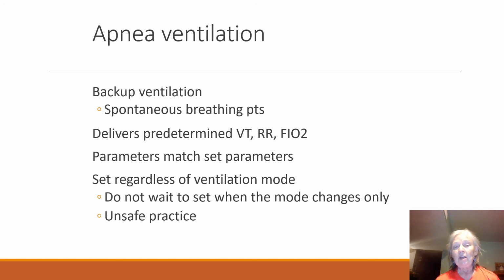She stopped breathing. 300 is a whole lot less than 900, and unfortunately she died within seconds of the second or third apnea breath that was given to her. So you always want to make sure you check everything. When you sign off, either electronically or on paper, that you checked these different alarms, that's telling you that yes, you did it, and if something happens, you are liable for it.